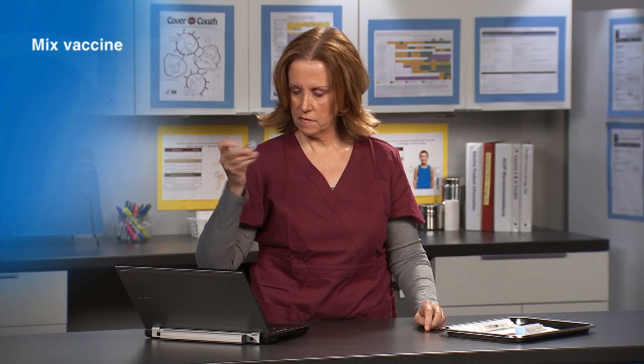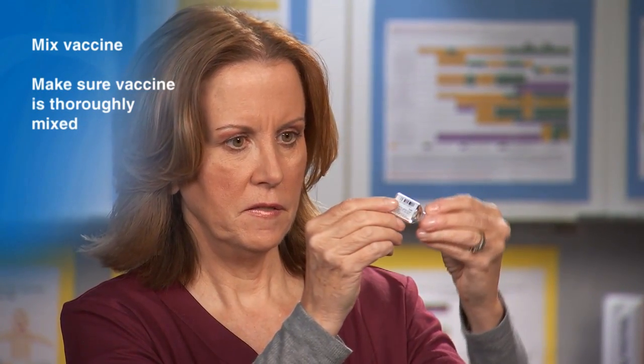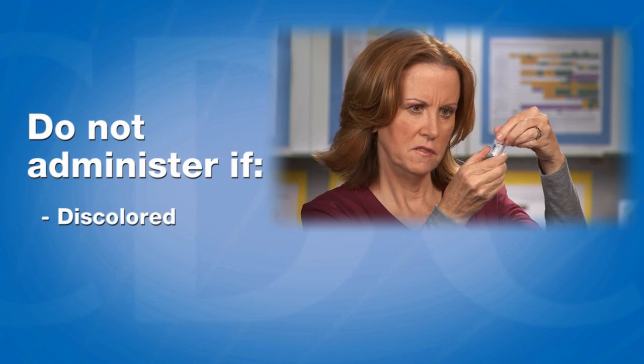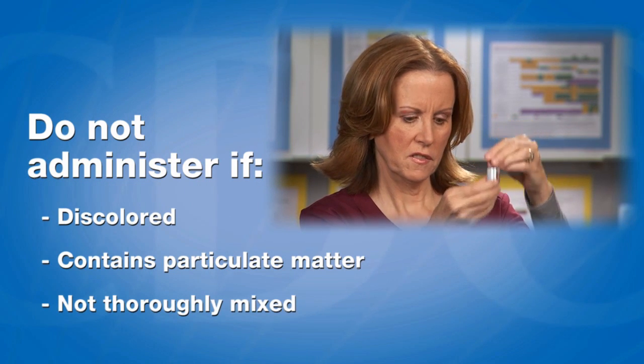Now mix the vaccine by shaking the vial. Check the vaccine to make sure it is thoroughly mixed, and make sure there is no discoloration or precipitate. The vaccine should not be administered if it is discolored, contains particulate matter, or is not thoroughly mixed.